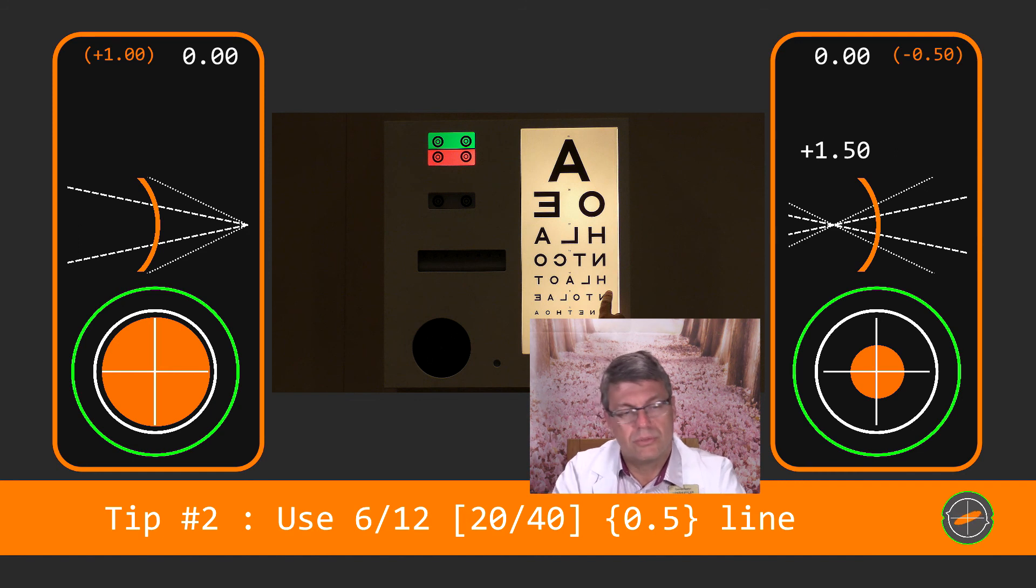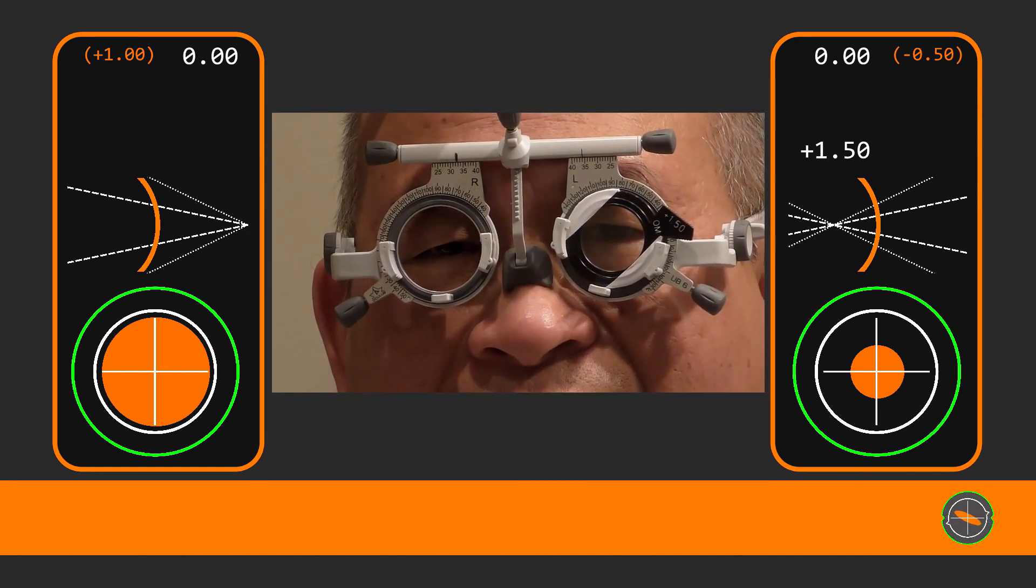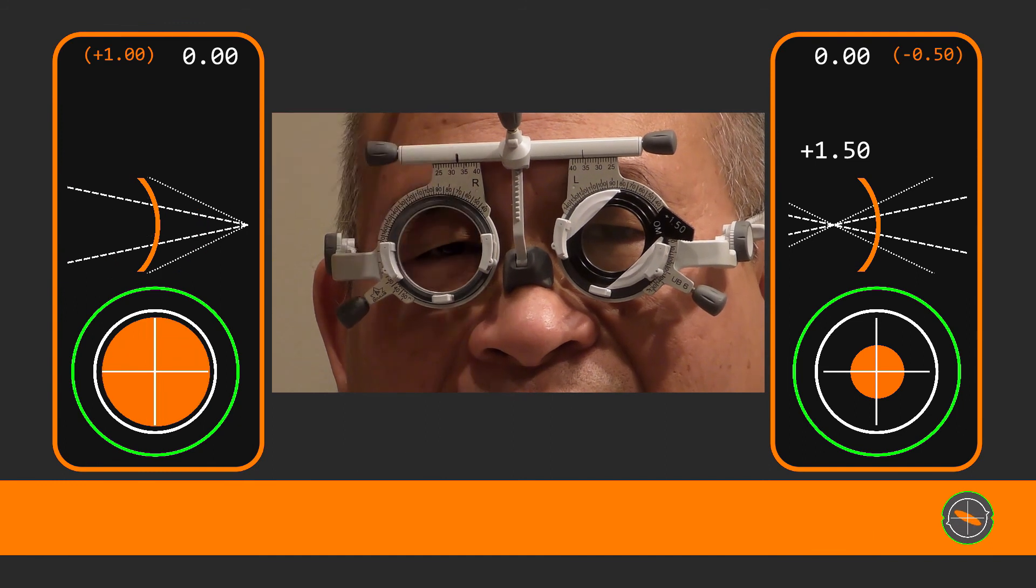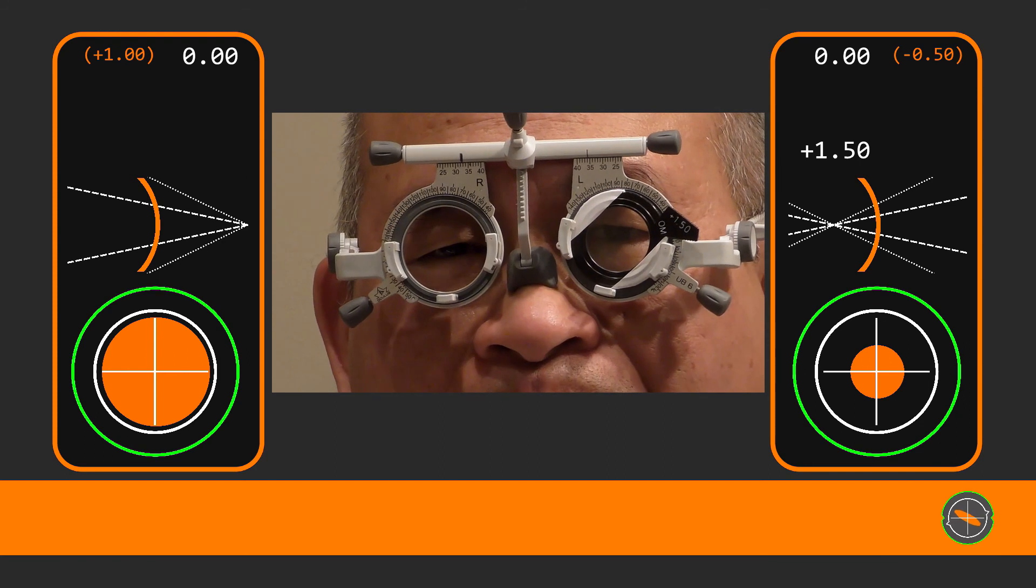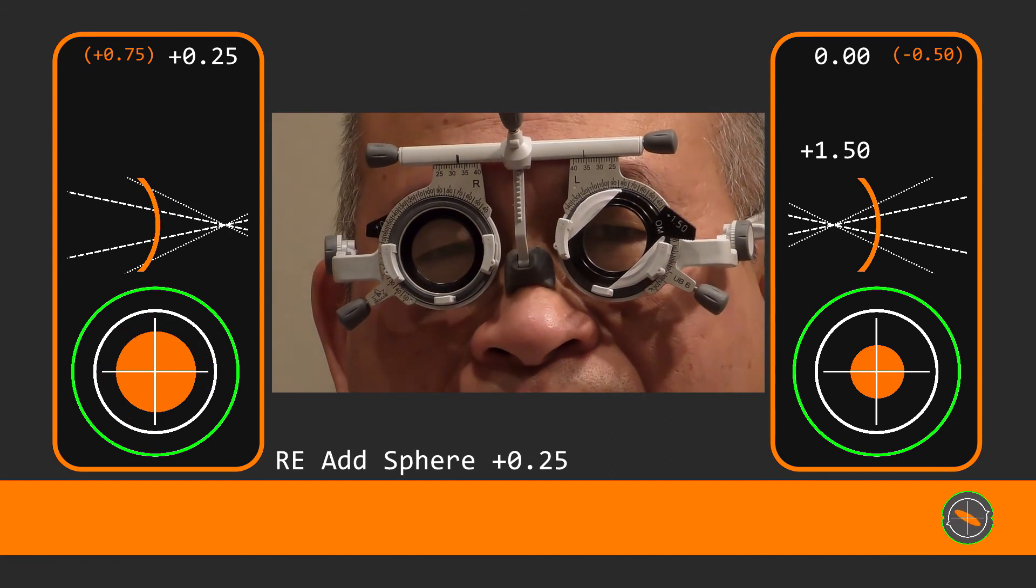Let's continue. And if you look at that line there. Is it better with this one or better with that? Better with.